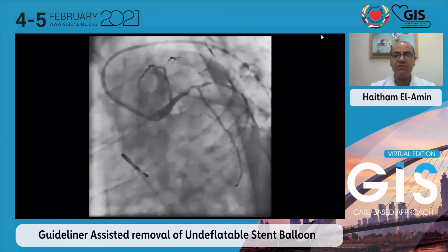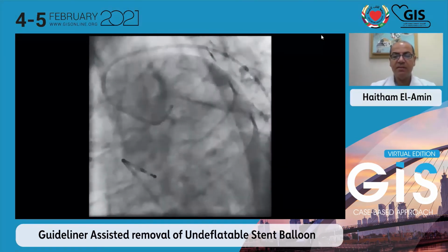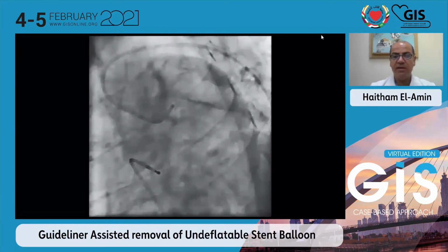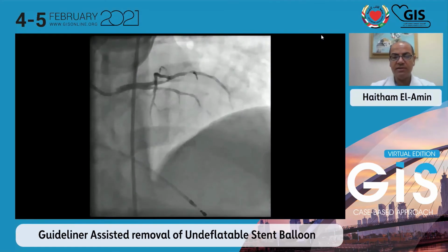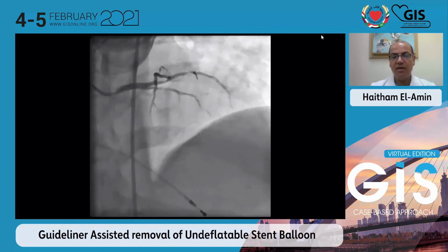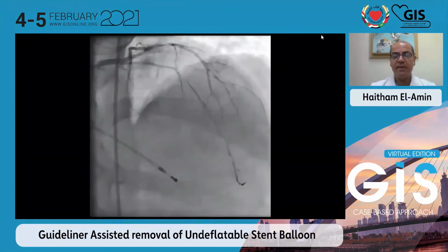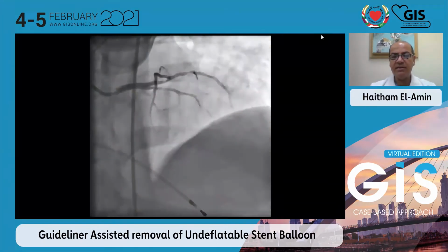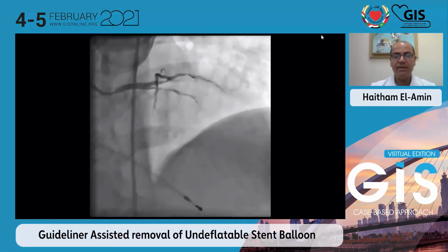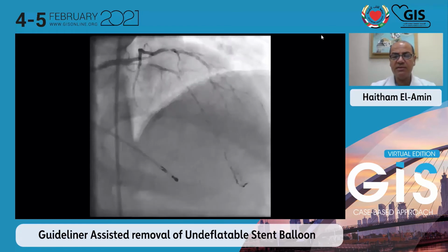This is a spider view showing you the hazy proximal LAD, which is likely the culprit for this man's presentation, as well as the circumflex disease. This is the cranial view showing you the extent of the disease and how small and diffusely diseased this LAD is in such a young man who's only 29, but has really significant diffuse distal LAD disease.